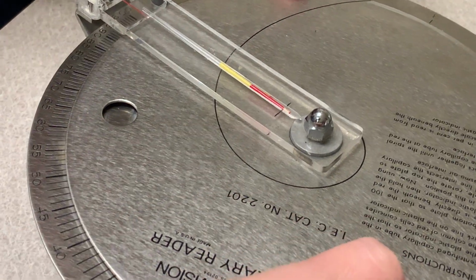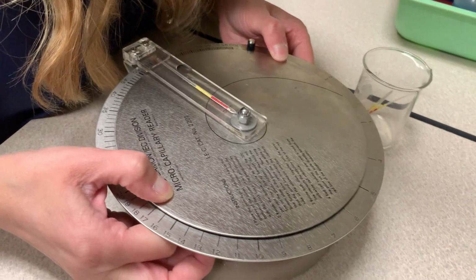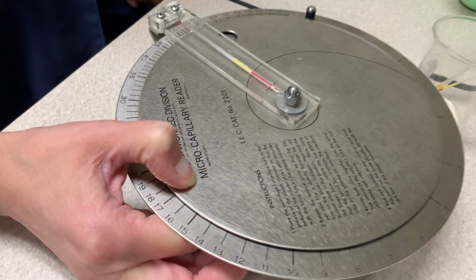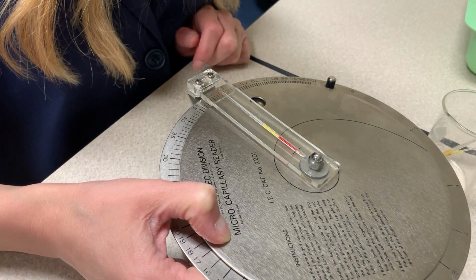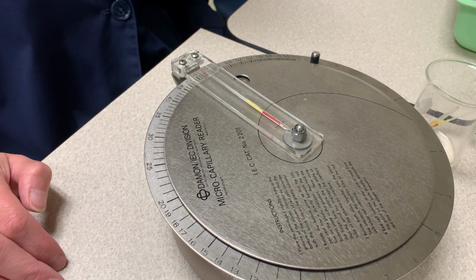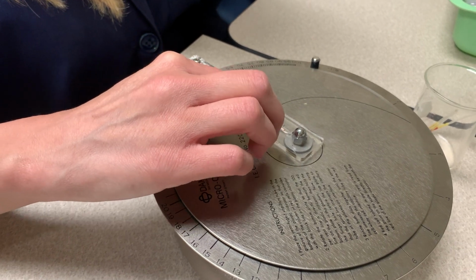Now we take both trays and we rotate until we are right at this line between the red and the yellow. And then you can read right up here the number. And this number is about 50, I guess about 52%. That's all you do. So what did we just figure out? The hematocrit. We figured out the ratio of the red to the yellow.